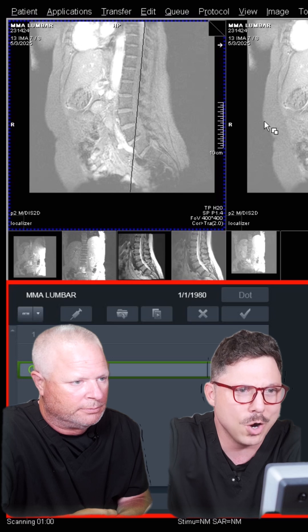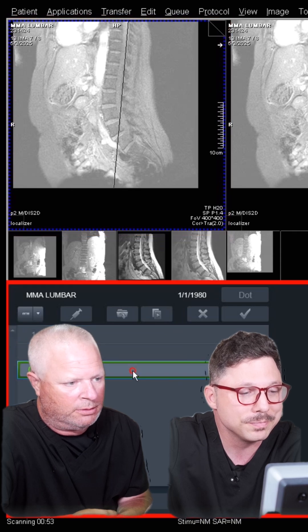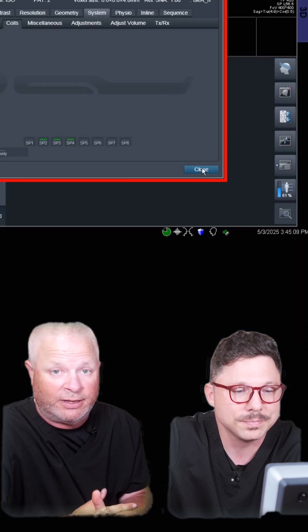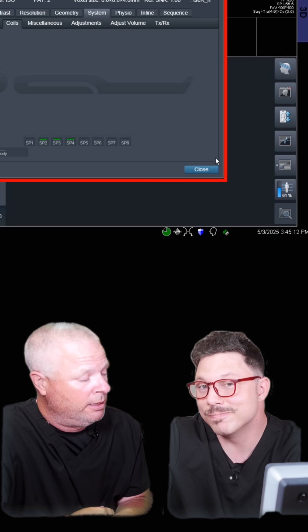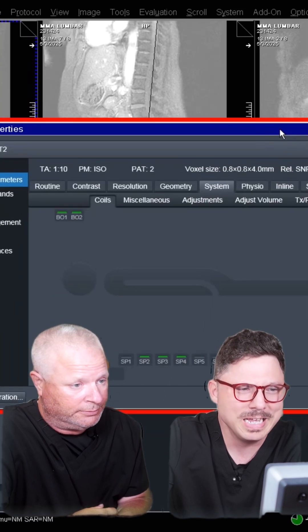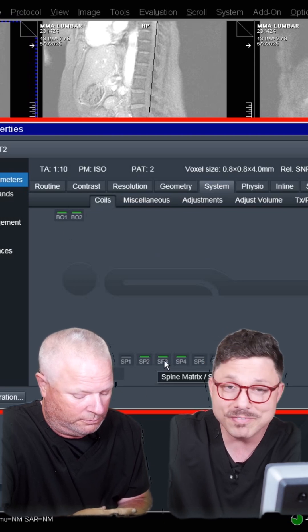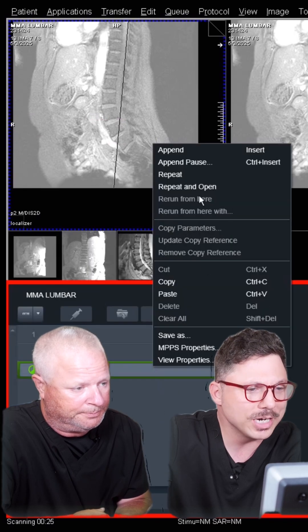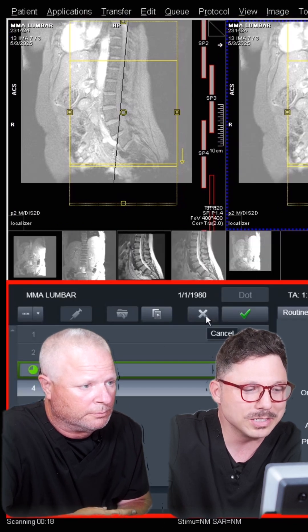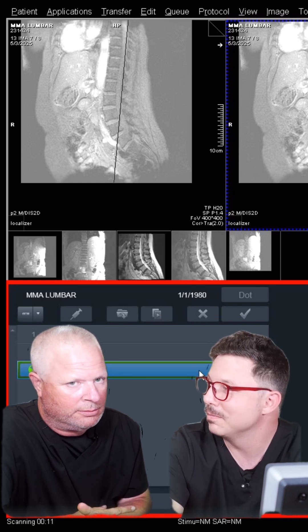We're learning each and every day — that's part of the fun of being an MRI tech. I learn something every day, and if I come to an epiphany that I know everything, that's the last day I'll scan an MRI — 30 years in and I still don't know everything. I just wanted to show real quick — we do have that 18-channel coil enabled behind the patient, supported by the table as well. The phase direction is going head to foot, so we shouldn't have to worry about breathing motion.